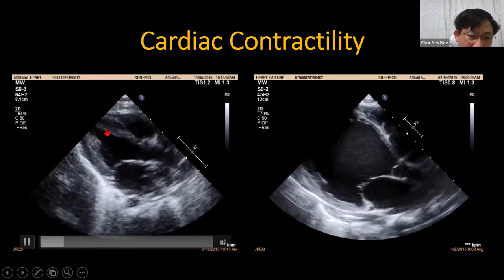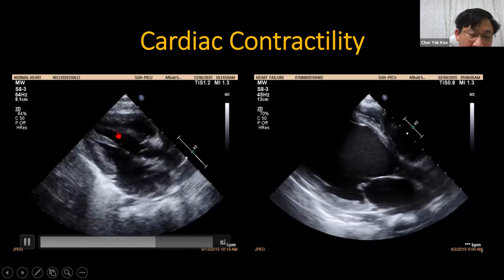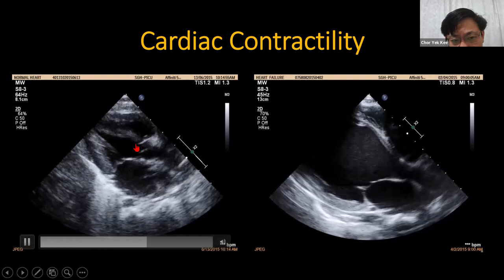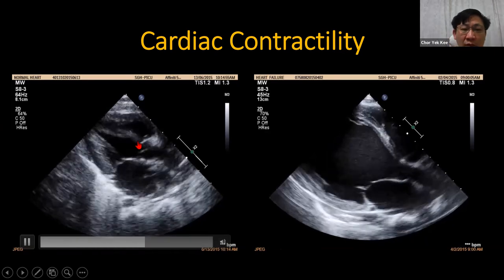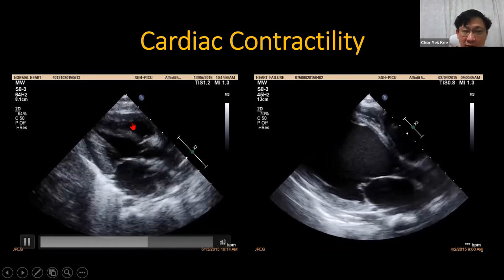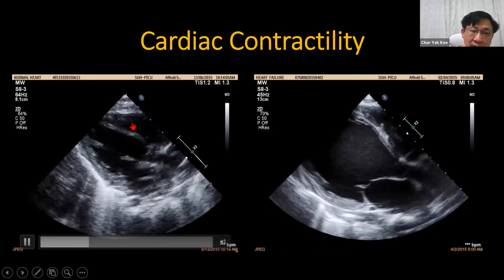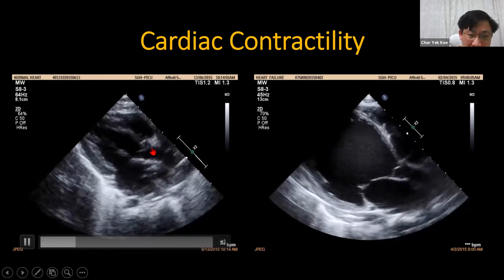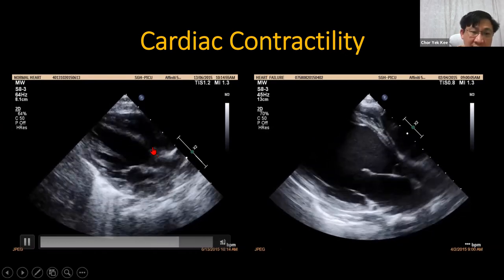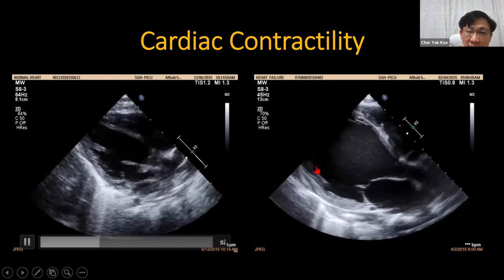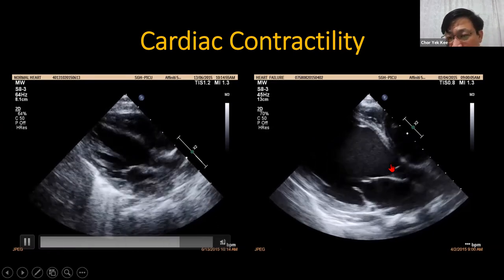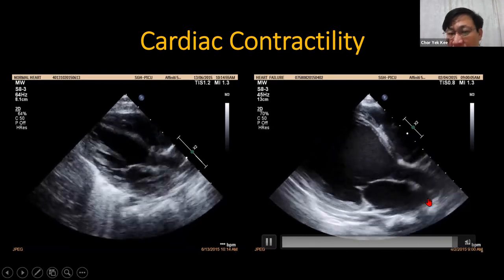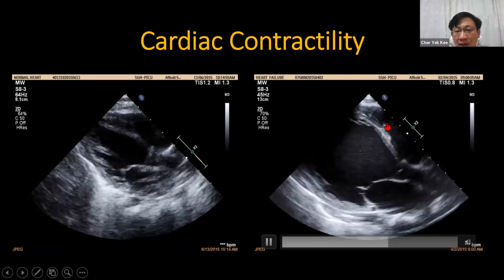In the long axis view, good contractility means the ventricular wall nearly comes together. We describe this as ejection fraction — how much the volume of the left heart changes between systole and diastole. You can see significant volume change in a well-contracting heart. In a poorly contracting heart, the left ventricle is very dilated with little volume change — this is a poor cardiac output state.